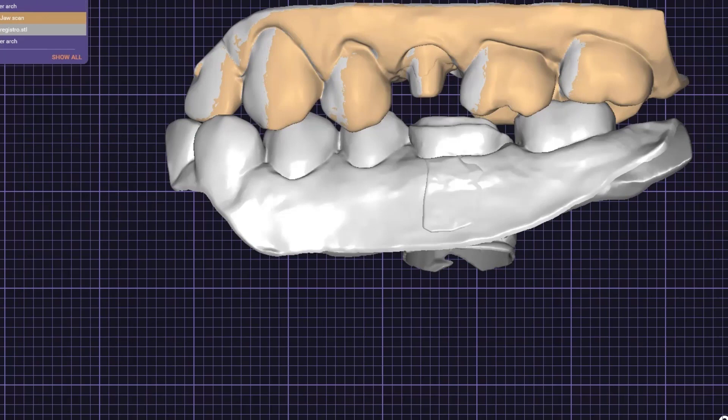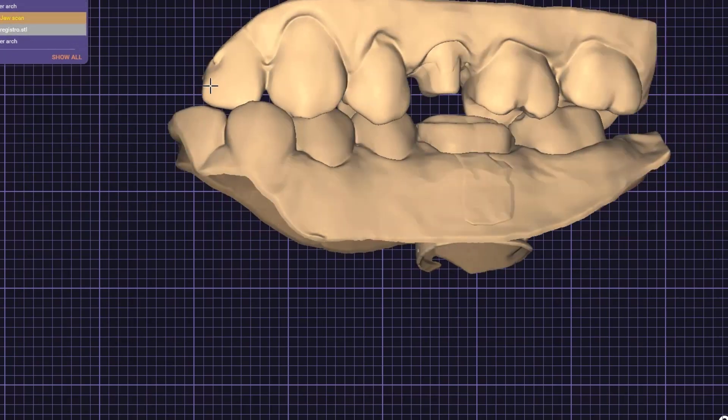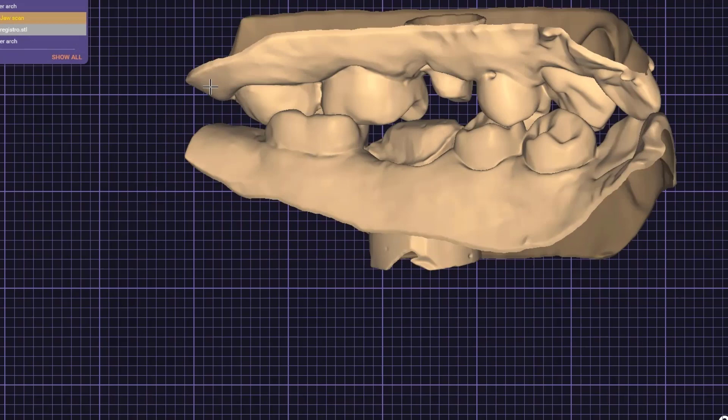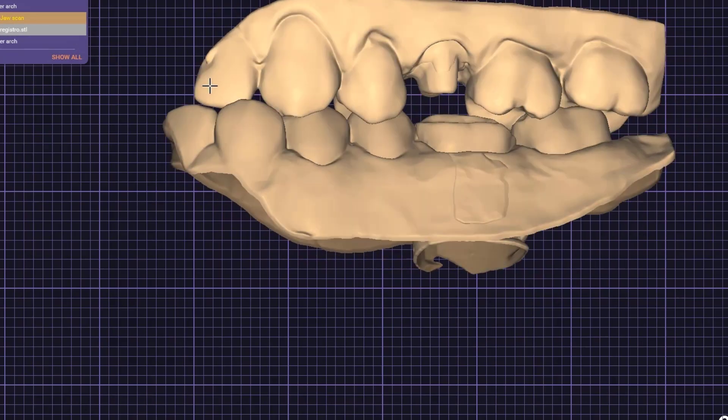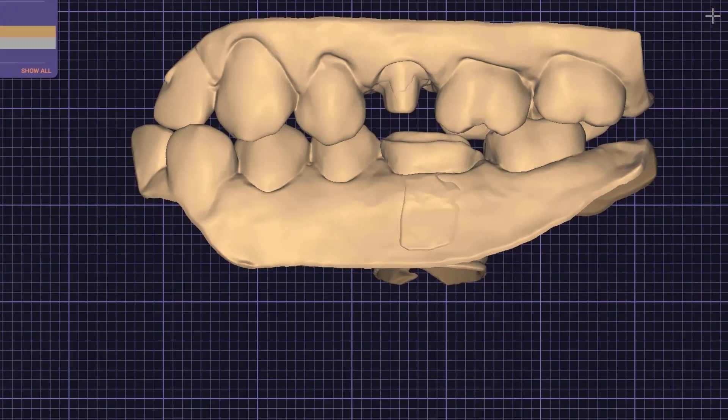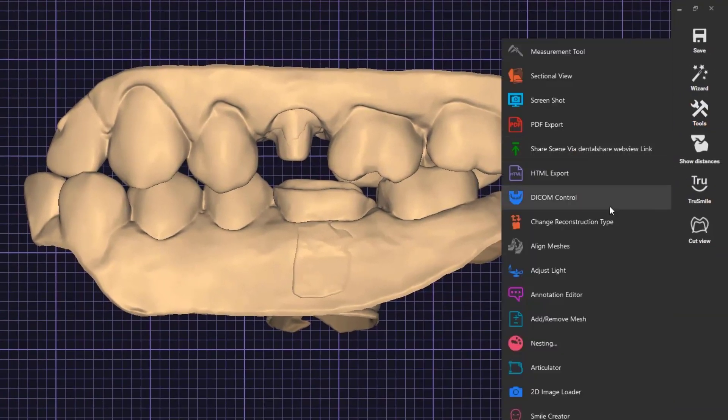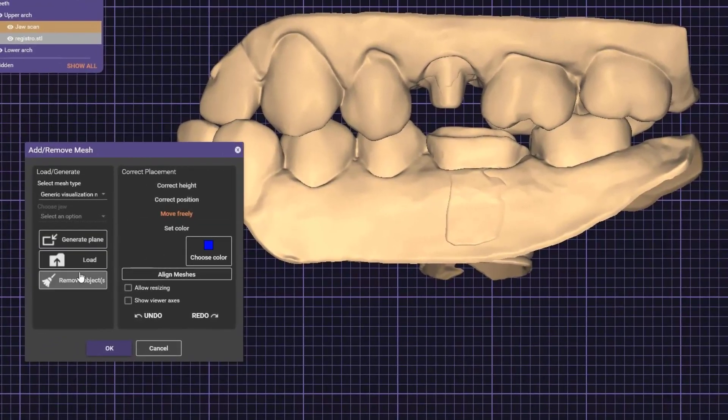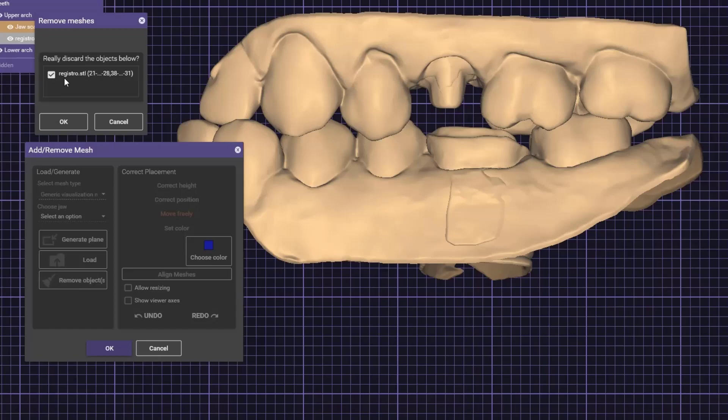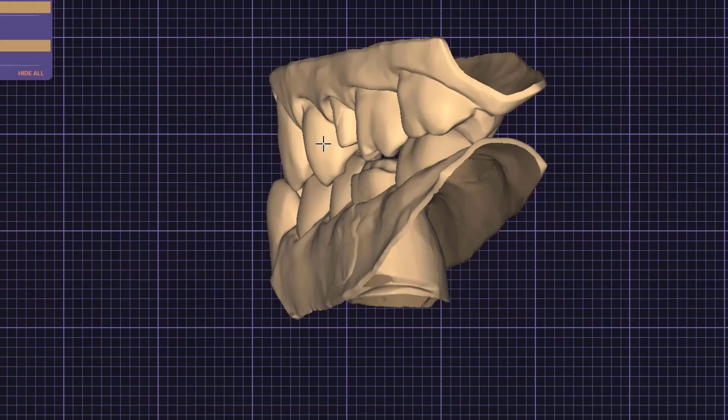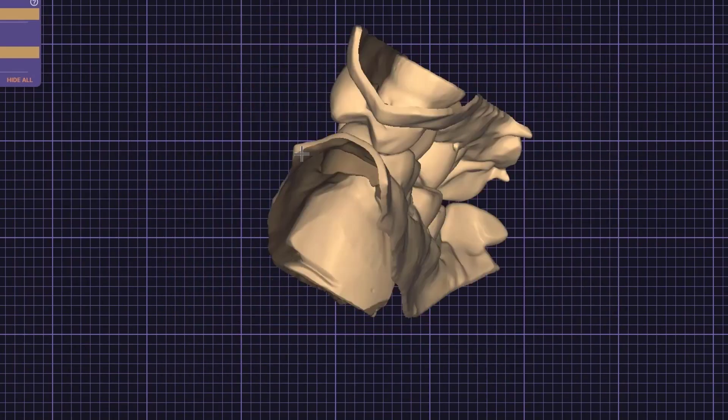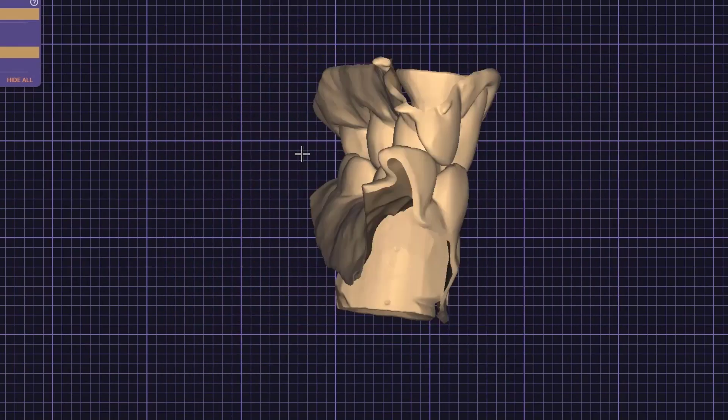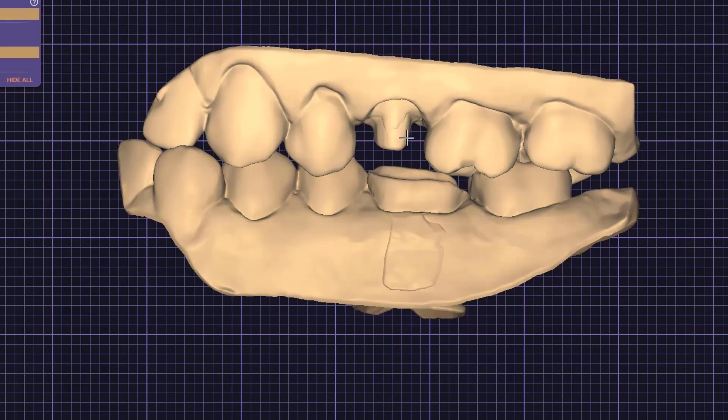As you can see, the scans are in the perfect position. Let's get rid of the bite scan. Remove object, select the STL of the bite scan, and click OK. That's it. Now we have the scans perfectly in the correct occlusion.